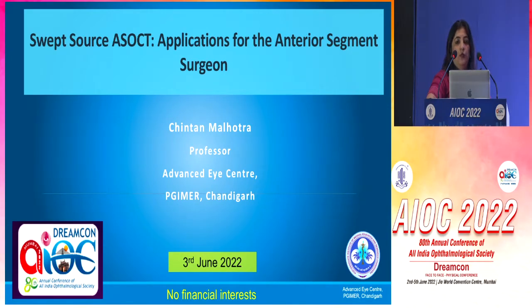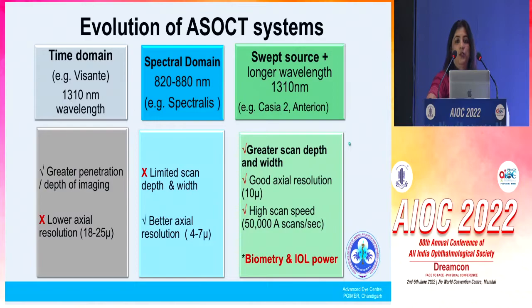What my talk will be focusing on mainly is the preoperative uses of the ASOCT, because the intraop use of the swept source OCT opens up a completely different dimension, as does the biometry. Time permitting, I will speak a little bit about biometry, otherwise it's mainly about the preoperative. Also, swept source OCT is used not only by cornea and refractive surgeons, but also by the glaucoma surgeons and the squint surgeons, because it helps to see all these structures so well. But this talk will be mainly about the cornea and refractive.